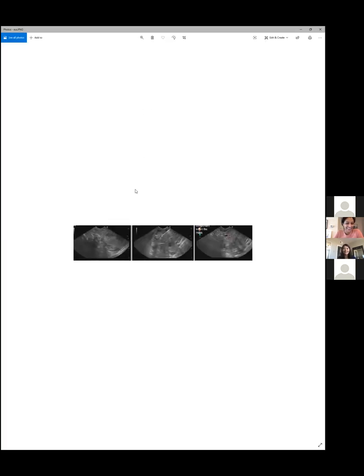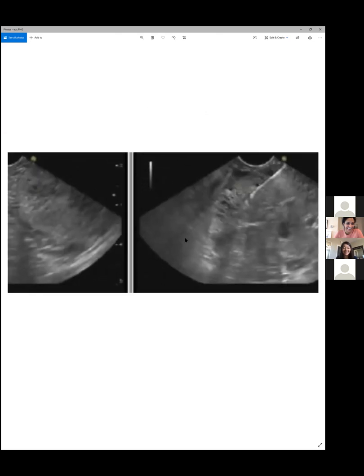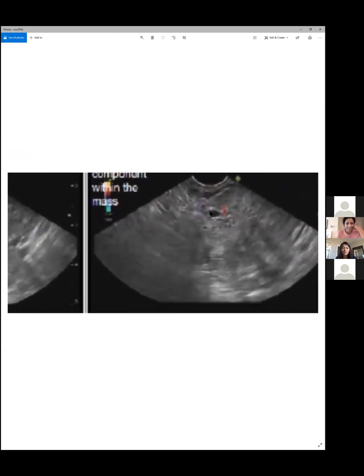We did this instead. So we did what Nelly would have done. And these are not the highest resolution of images, I'm sorry, but we did endoscopic ultrasound. And you can see a needle coming into this thing here, and they described it as a mass with some cystic spaces. So here they're trying to show one of the little cystic spaces. And the FNA was non-diagnostic. So that doesn't really help a ton. So then we went and did the MRI.